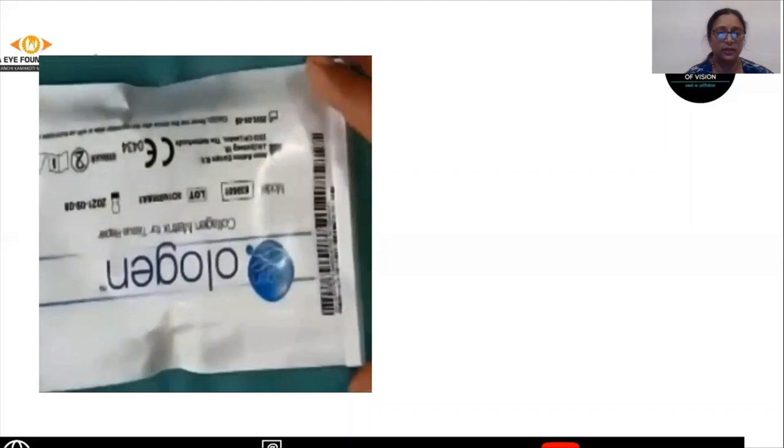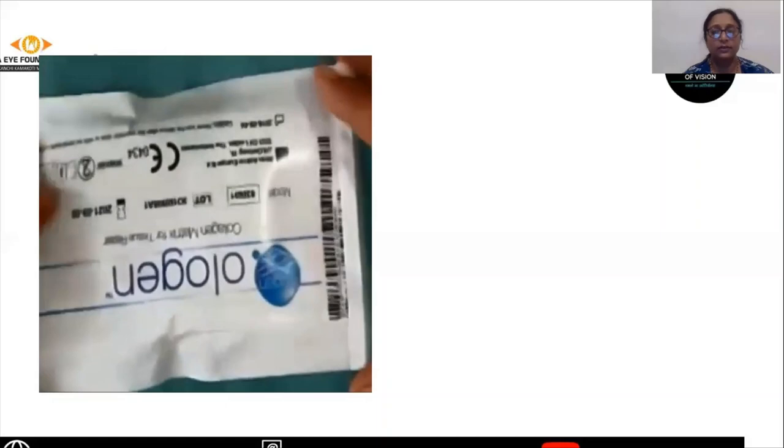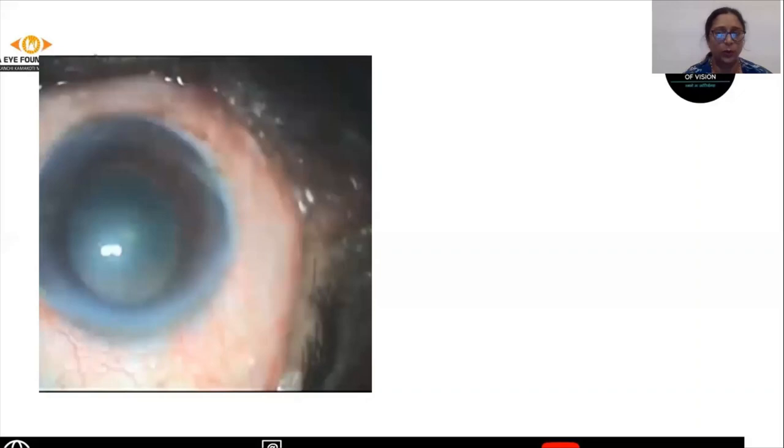Other things which may be used is the Ologen. This is a collagen matrix which is used for tissue repair. This can be used instead of mitomycin C. It comes in a packing like this, and inside has a collagen matrix which could be circular or square in shape.